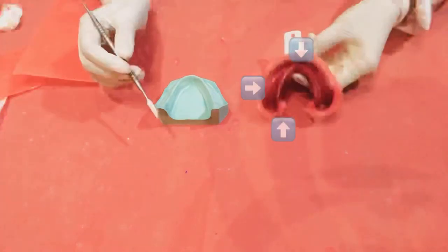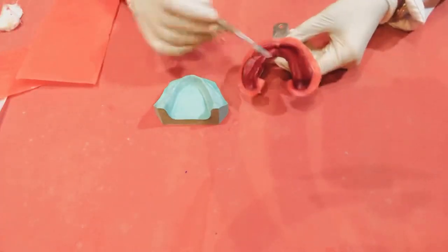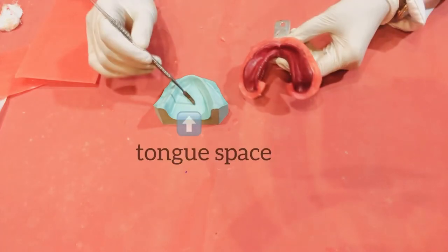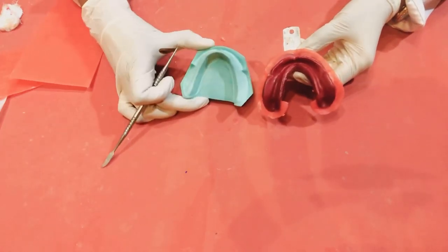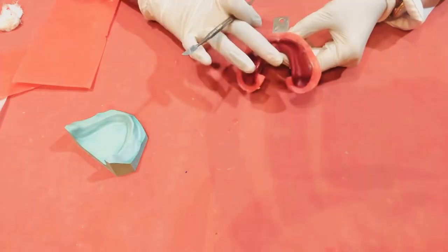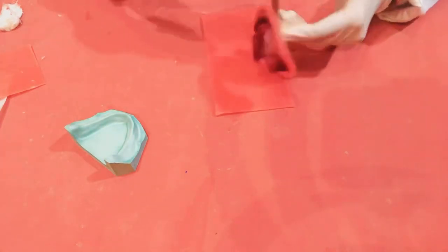Now for the lingual side, you can see that there is a tongue space in the cast. In order to create it we have to contour and seal a wax sheet to the lingual borders of the impression. This is how I do it, it's quite easy and fast this way.